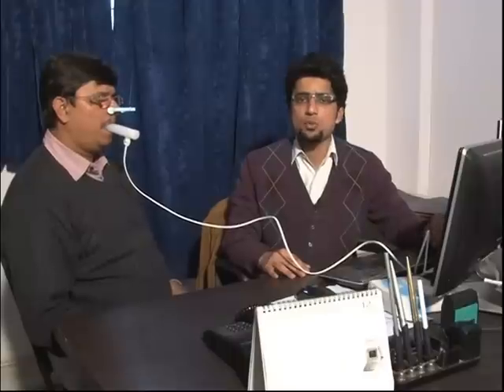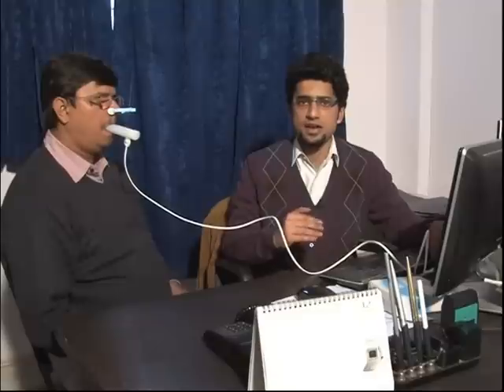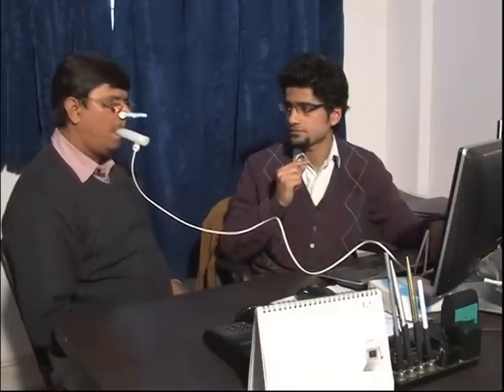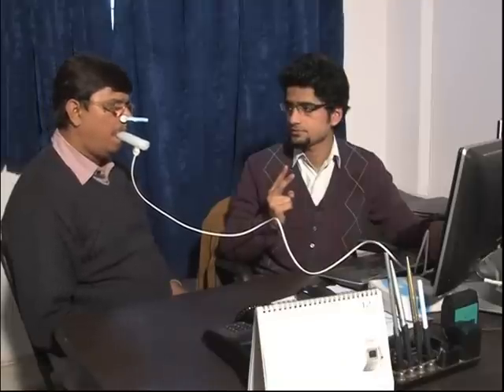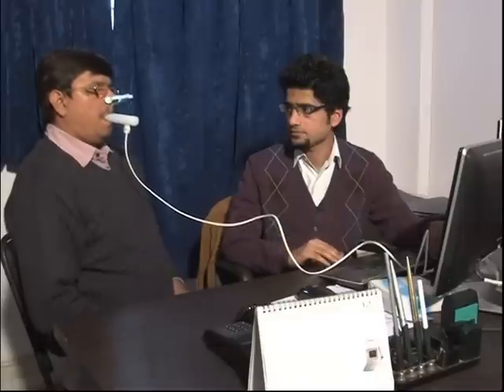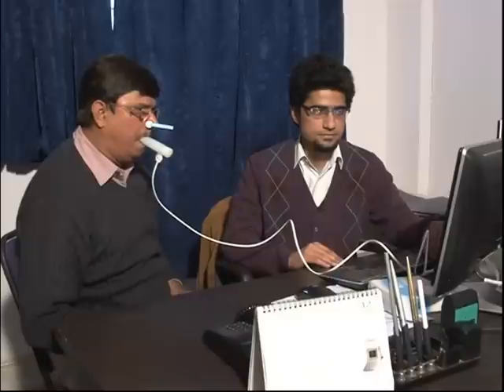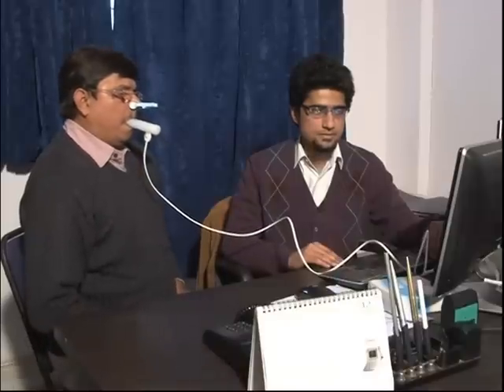The patient is advised to take 3 normal breaths and then inspire deeply and then expire very hard for 6 seconds, and it is reflected on the screen. The similar results will be shown on the screen now.